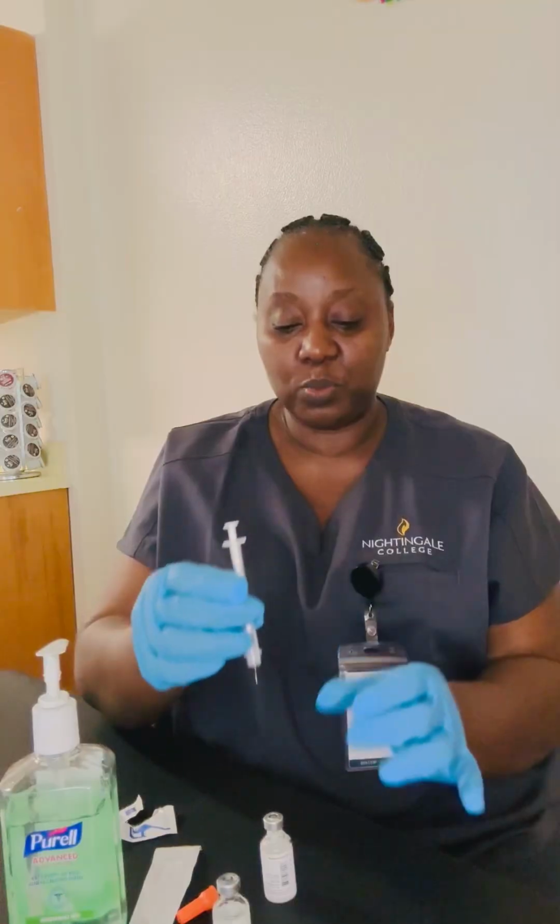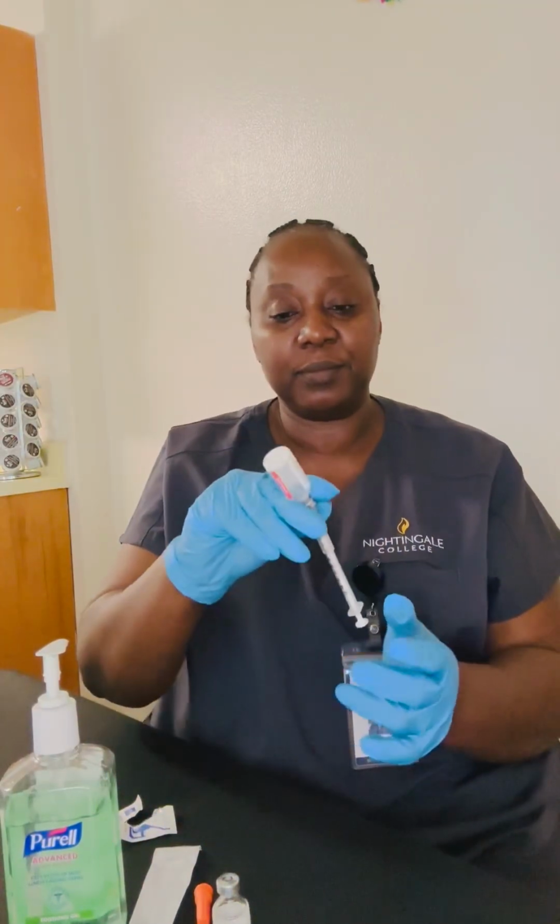Then I'm going to now draw up from the NPH insulin, the cloudy one. Like I said, we're not pushing anything. I'm just putting the needle in, and immediately I'm going to flip over to draw because I'm not putting any air.